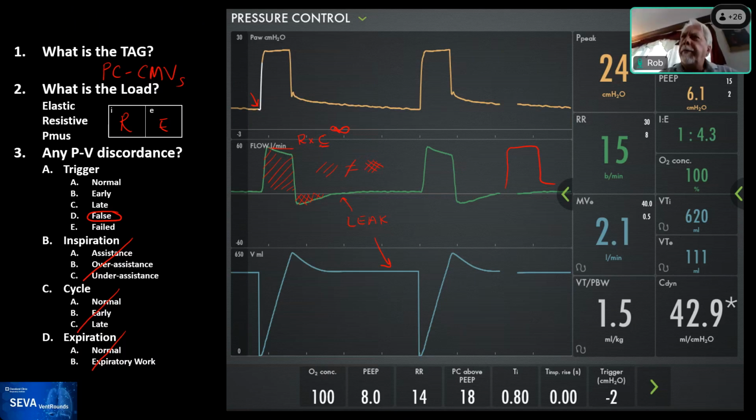Yeah, well, I wrote a paper on this once. I'm trying to remember what I said. I have to go back and read what I wrote. But there is a difference given the mathematical model that I was telling you about. And as I recall, pressure control does slightly better.